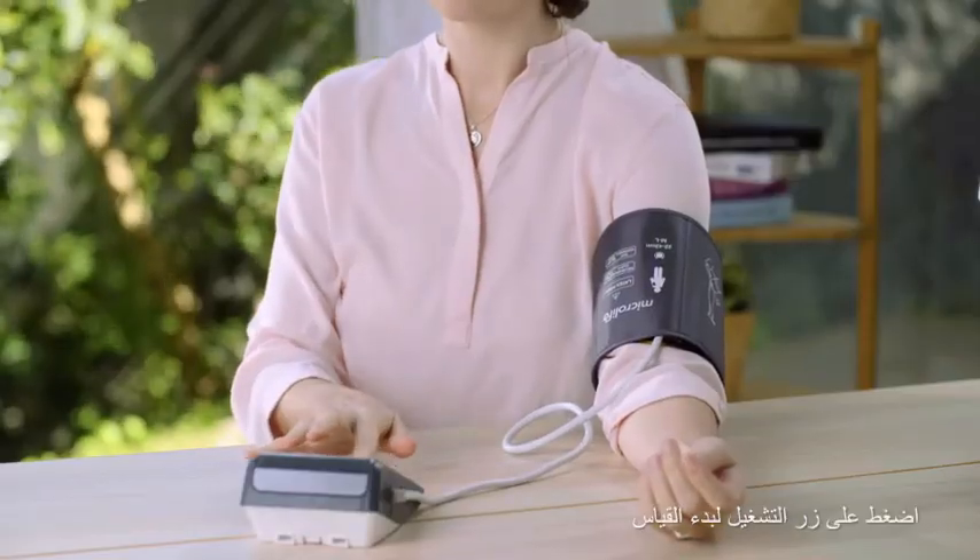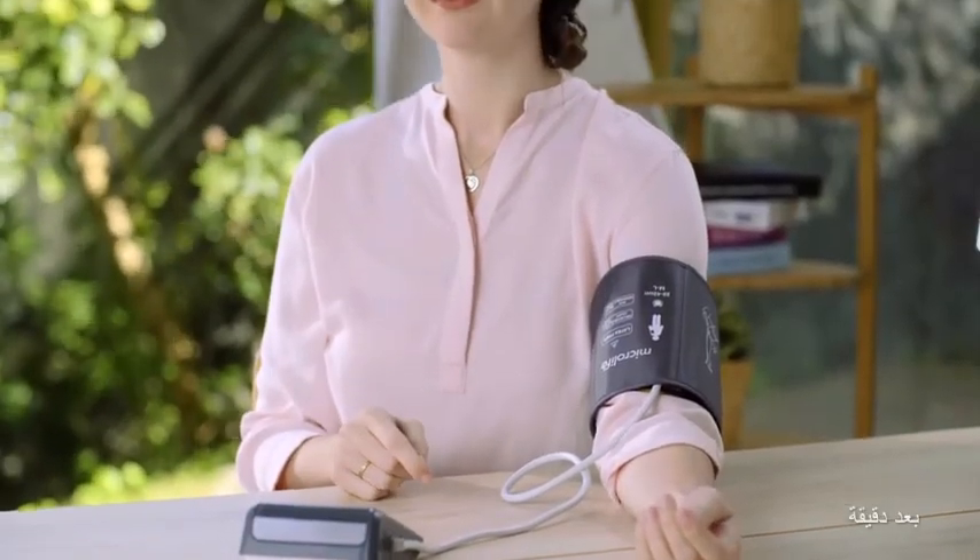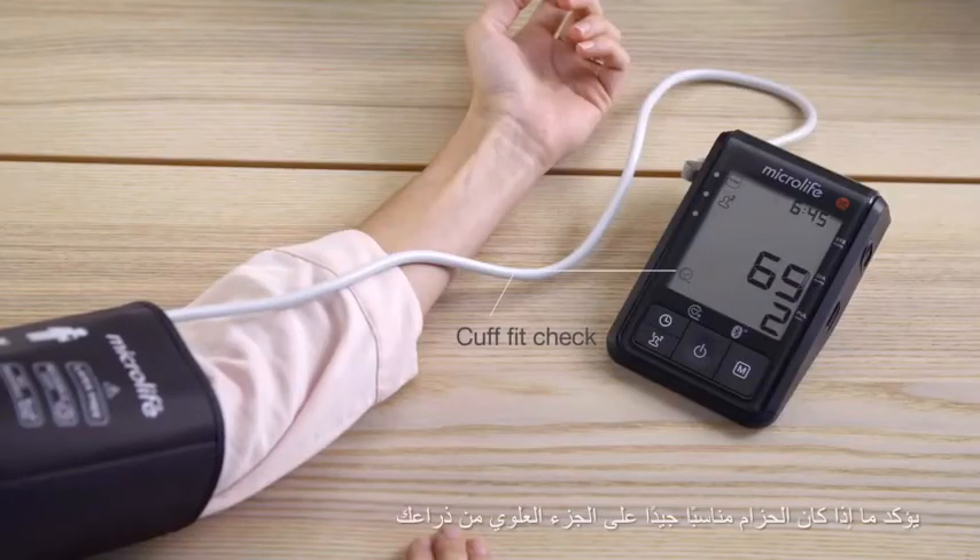Press the ON button to start the measurement. A moment later, a check mark in the cuff symbol confirms whether the cuff is fitted well on your upper arm.